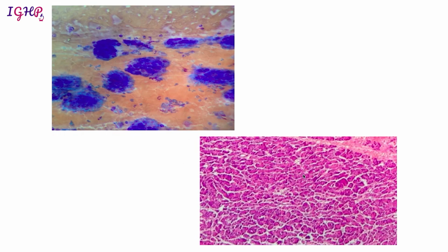So now, suppose there is a lesion in the pancreas, and through the duodenal route they have entered the pancreas, but they have not actually hit the lesion, and the needle is just going into the normal pancreas. This is the normal pancreas, where you see numerous acini present, and on cytology these acini are going to look like this.